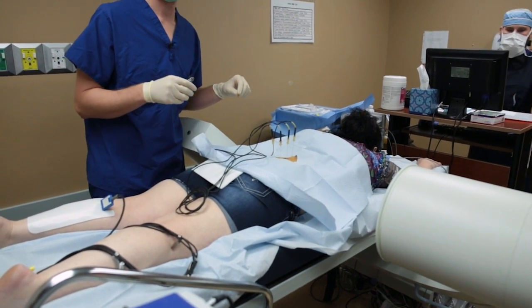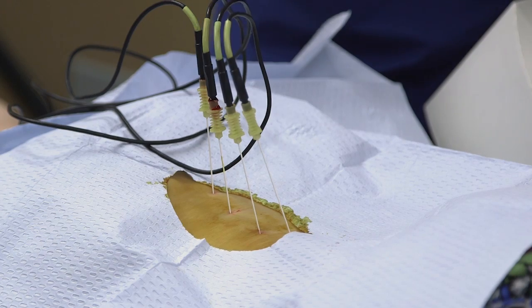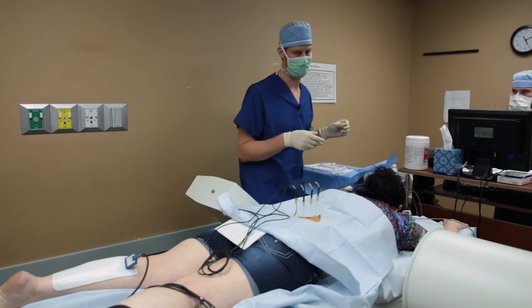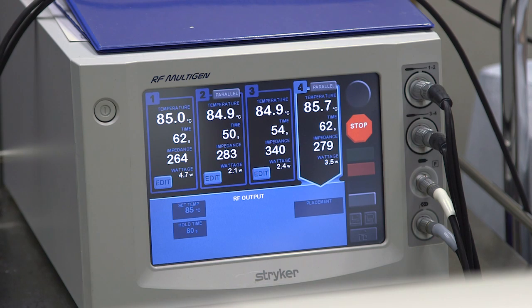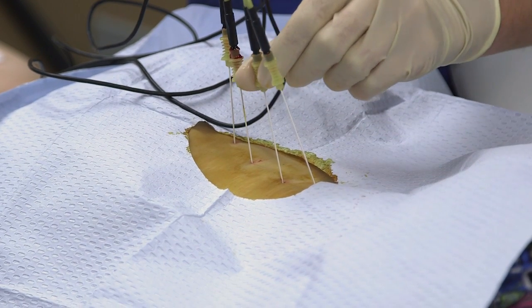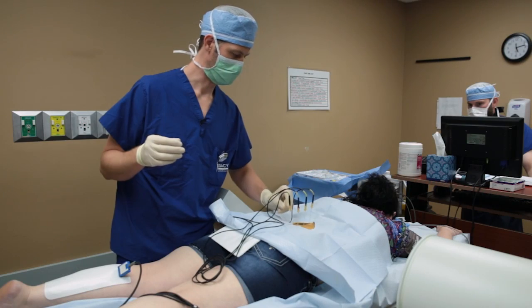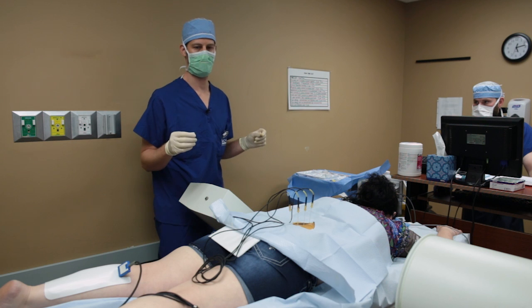After confirming the needles are in the correct position and placing numbing medication, we'll start the burning or rhizotomy part of the procedure. There are two rounds of this, each lasting about 90 seconds. Sometimes you'll feel it in your back as we start to heat up. We then rotate the needles 180 degrees to make sure that we contact all of the nerve we're trying to destroy, then do one more 90-second rhizotomy or burn.